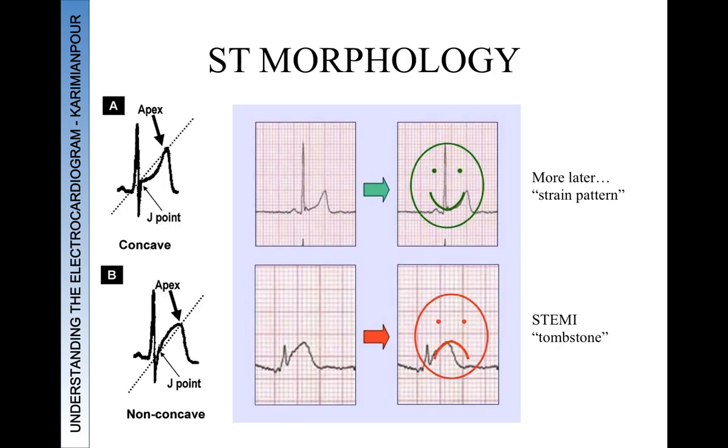So there's a little bit more to the ST segment elevations, and that's the ST segment morphology, because as you probably know, J point elevation or ST elevation has many, many causes, and not all of it is due to an infarction. So we look at the morphology.